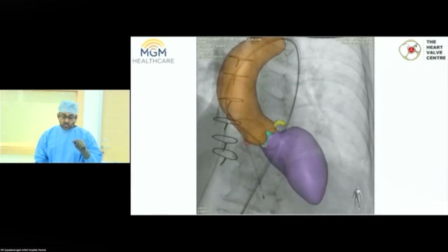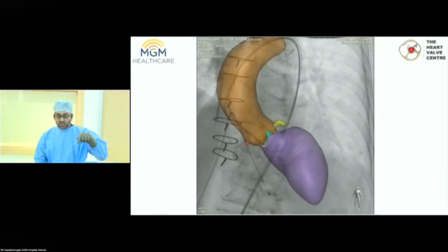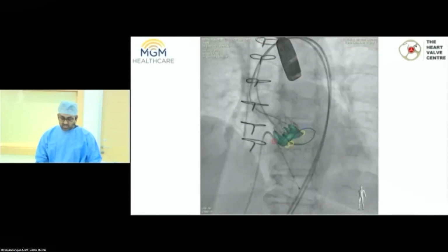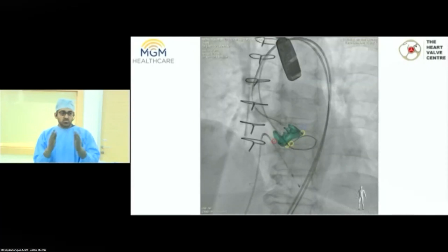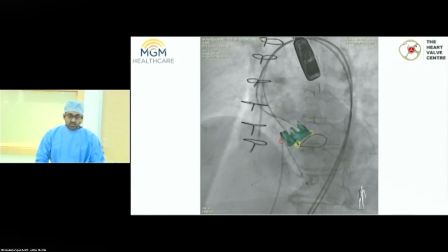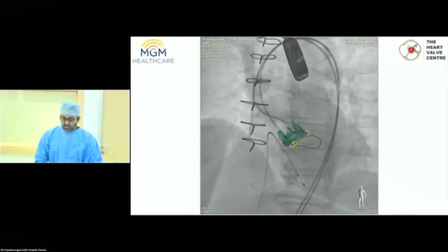You can see here we are checking that we are indeed going to cut through the left coronary leaflet by injecting some contrast. You can see here we're just next to it. Again, multiple projections to be absolutely sure because we really don't want to get the leaflet wrong, and we did want to make sure the bullseye target is perfect.